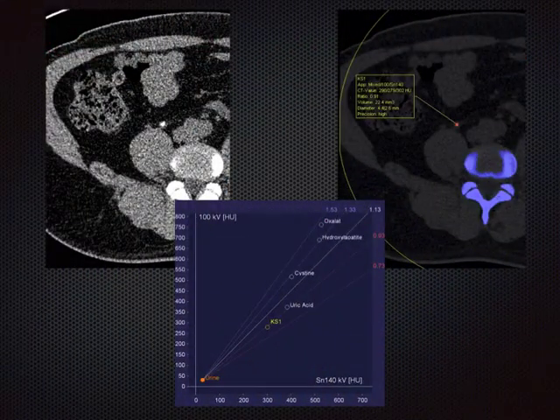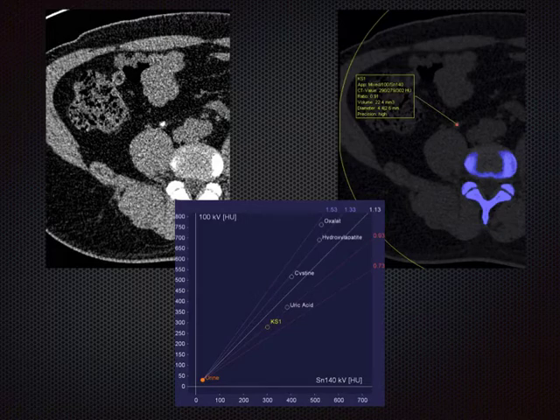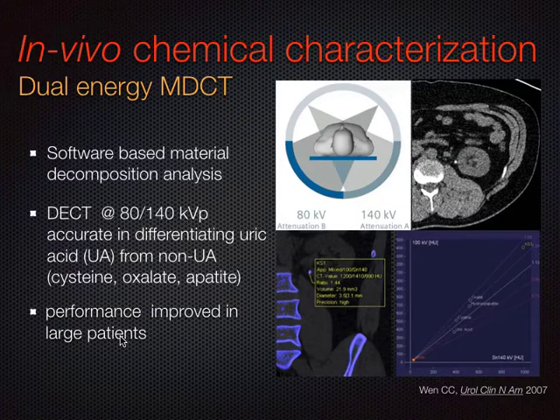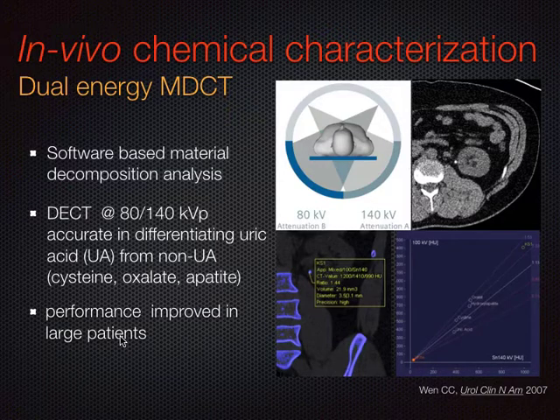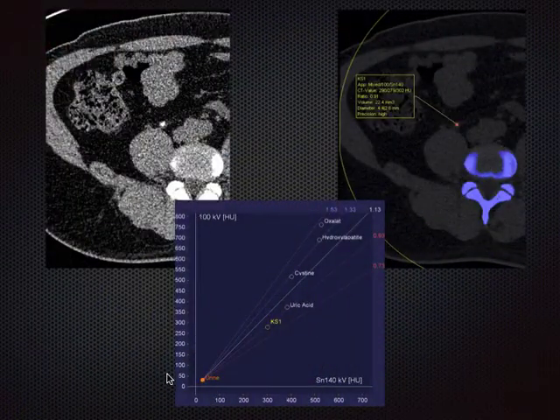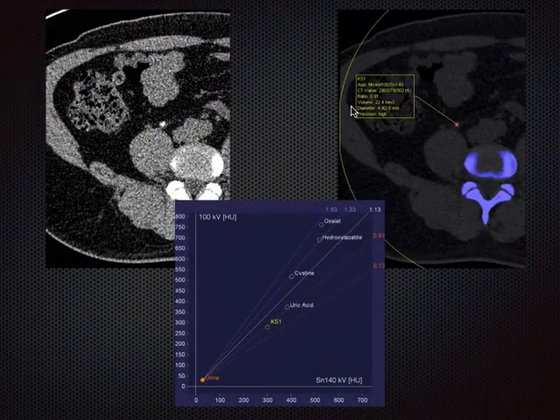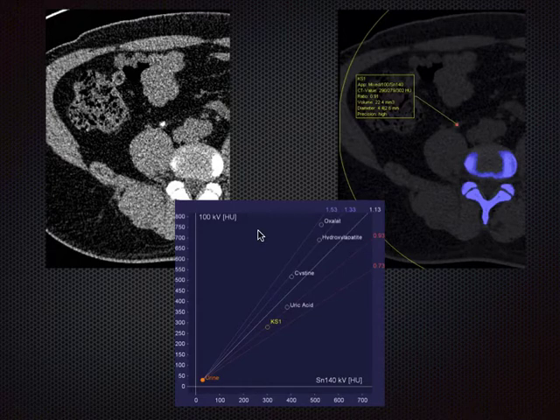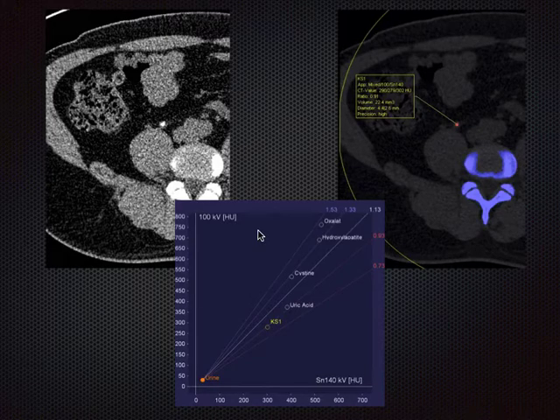In centers that have dual-energy capability, we can do this composition analysis. It's been validated in clinical use. Originally the first scanners didn't perform too well in large patients, but those limitations have been mostly overcome with the latest generation of scanner. Uric acid stones are provided with a red overlay value—this is obviously important because if you know a small stone is uric acid, you can promote spontaneous passage and dissolution with oral alkalization therapy.